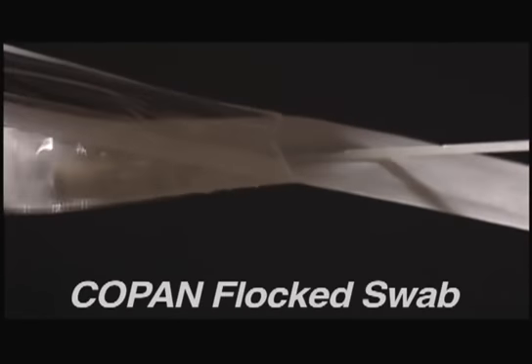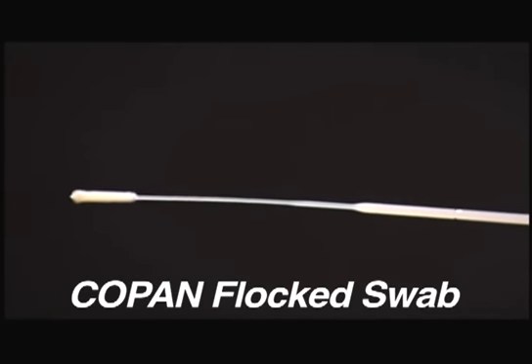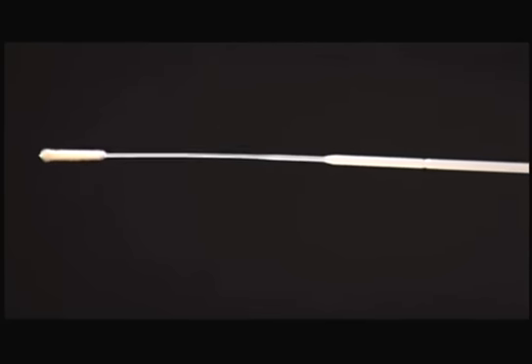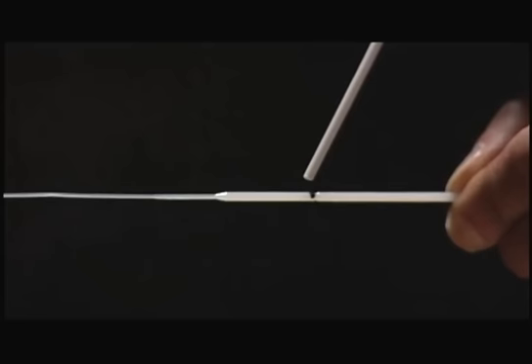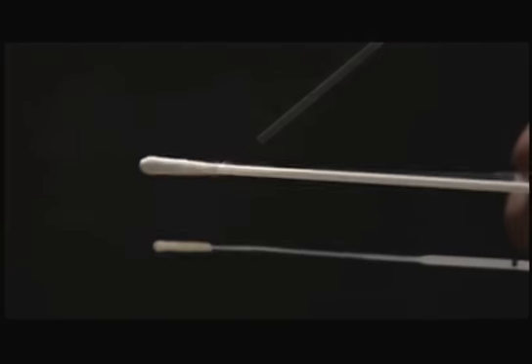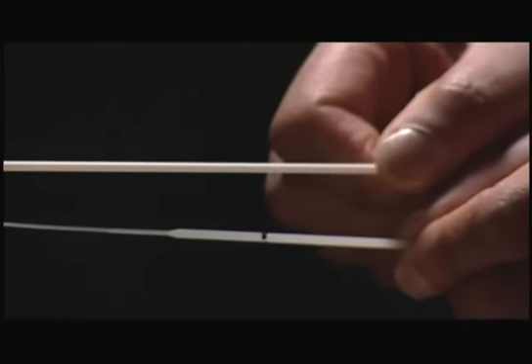As you can see, the swab has a furry tip, and studies conducted at the Provincial Laboratory and from the literature show that this feature increases the removal of cells which are both infected and uninfected, thereby lowering the rejection rate of unsuitable samples and improving the positivity rate of samples. The shaft of the swab has a thicker diameter at one end where you hold it, and it progressively narrows to a thinner end, culminating in the furry piece. Do not confuse this nasopharyngeal swab with a throat swab, which is shown here for comparison.